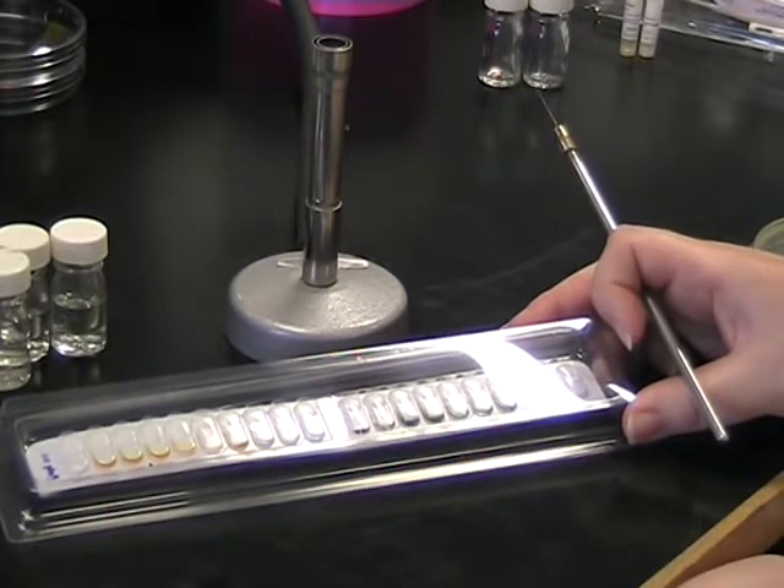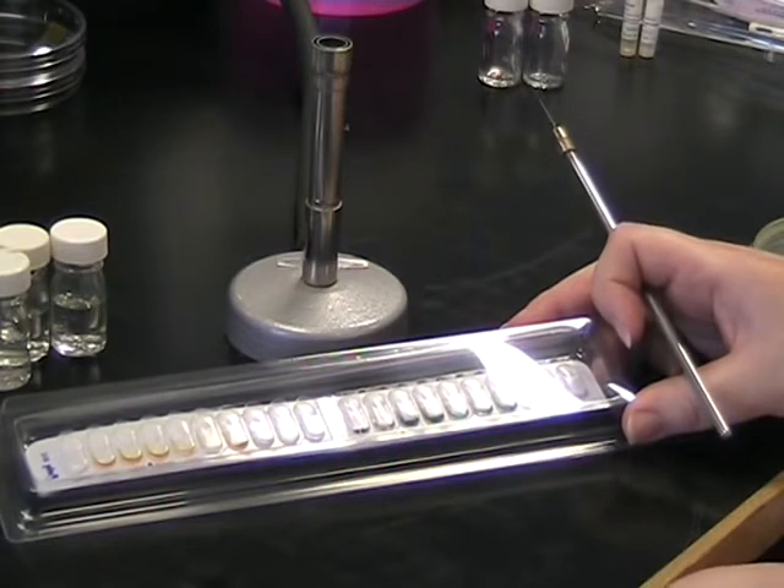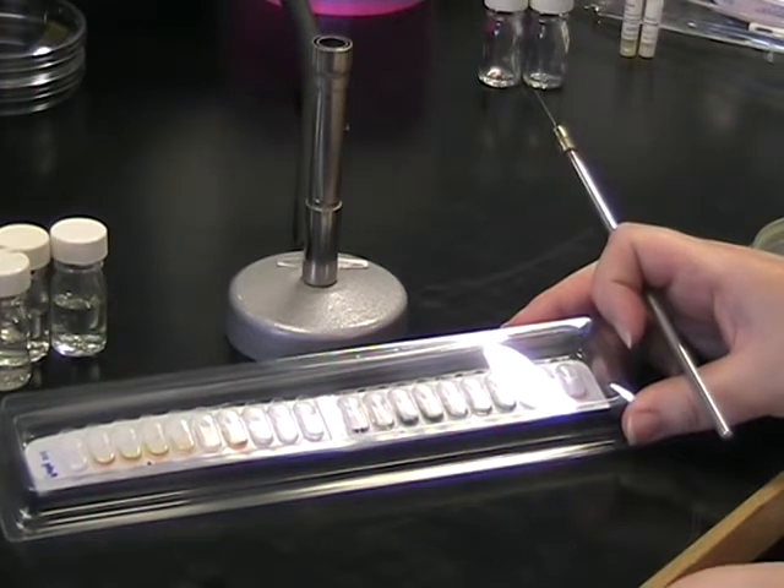I'm going to show you how to set up an API 20E strip to test for Enterobacteriaceae. This consists of a series of cupules which contain the reagents for individual biochemical reactions.